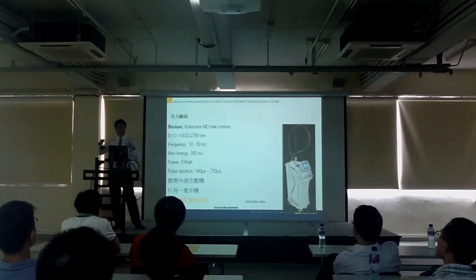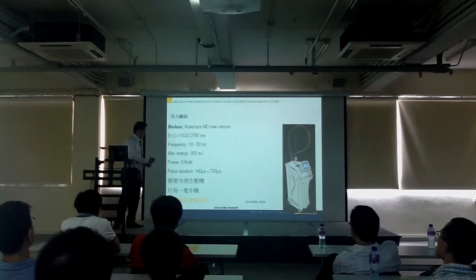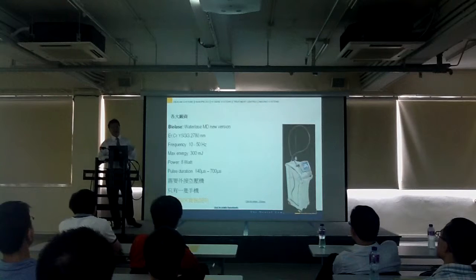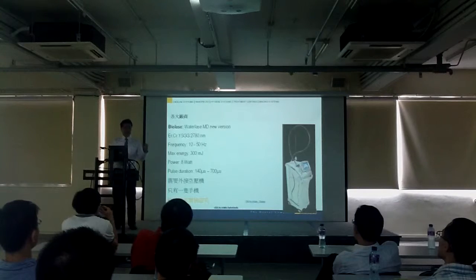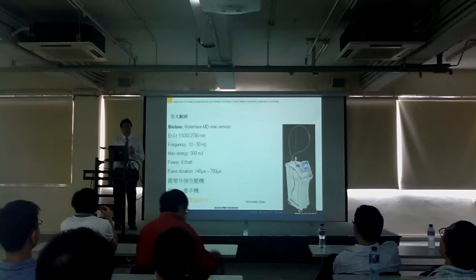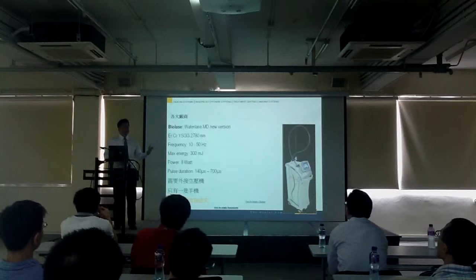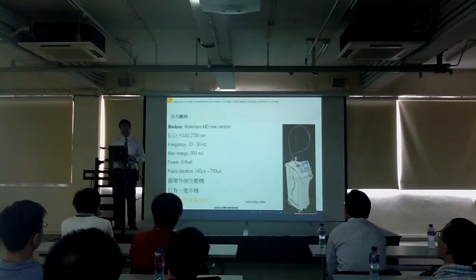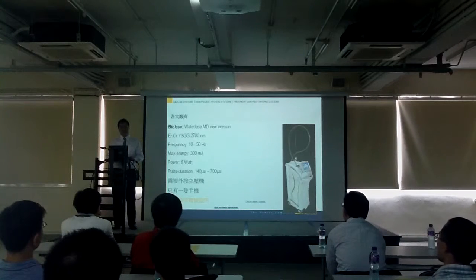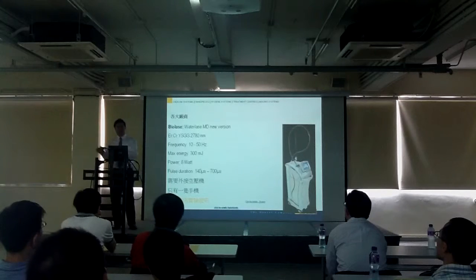Yes, there are water blades in the industrial world, but not in the mouth. It still cuts by laser. This is a marketing hoax. They tell you lies for you to buy a laser. It still works as a hard tissue laser, but less efficient, and they tell you a lot of lies. You really have to use it for a while to find out the full capability. There are a lot of lawsuits around the world on water lasers for false advertising and false promise from the sales rep to the dentist.